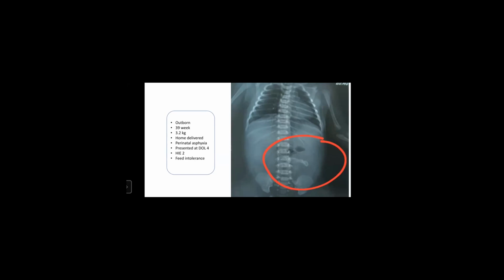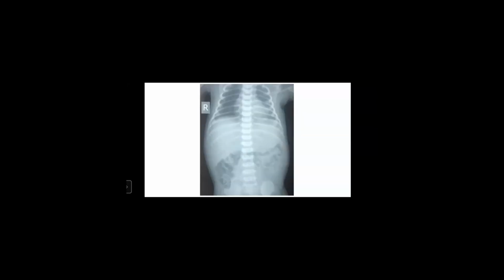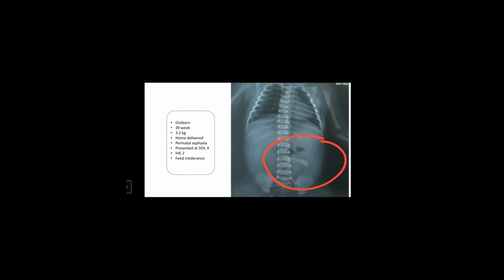All right. First, let me show the other X-ray which we got after 24 hours of admission. Ankit, next slide. So after 24 hours, still the feed intolerance persisted. We were not able to start the feeds, but that shadow had gone within 24 hours. The previous slide, yeah. So anyone can try now. Any guesses?